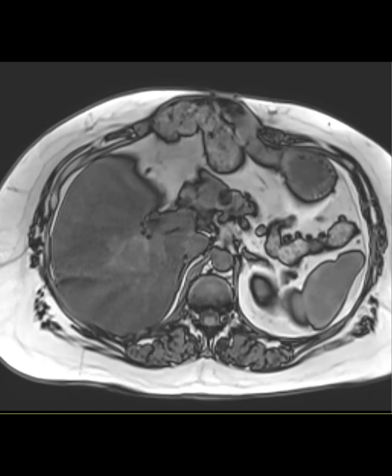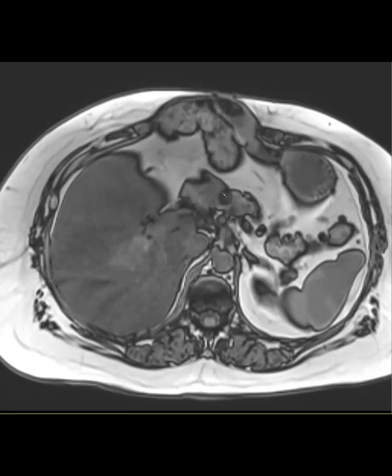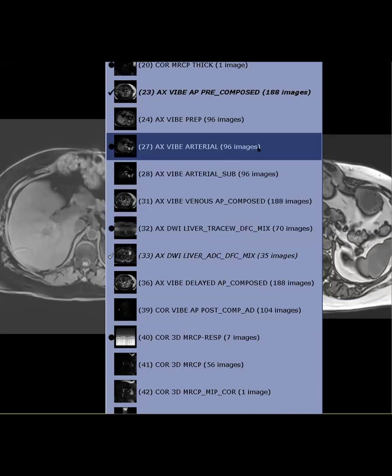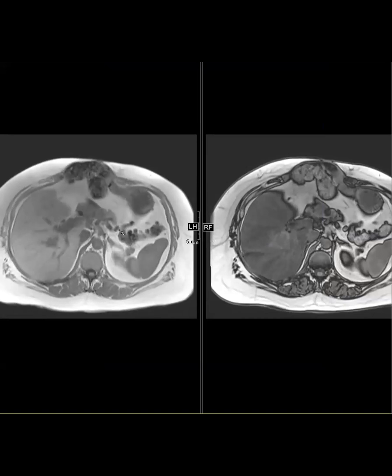Okay, well, basically, anyway, I found an AJR article saying that if you have a lesion in the kidney itself and you're trying to determine if it's a clear cell RCC with intravoxel fat or a lipid poor AML, you can use a 20% signal intensity drop, and the clear cell RCCs will have more than 20% signal intensity drop. So for example, this lesion, although this is in the pancreas, so we were much more concerned for a met, when you compare it to the in phase, was dropping like 50%. So it's more than that 20% signal intensity drop. Whereas lipid poor AMLs will tend to drop much less significantly, in the 10% or less range. So you can see this one had a lot of dropout. The more dropout, the more likely it's a clear cell RCC.